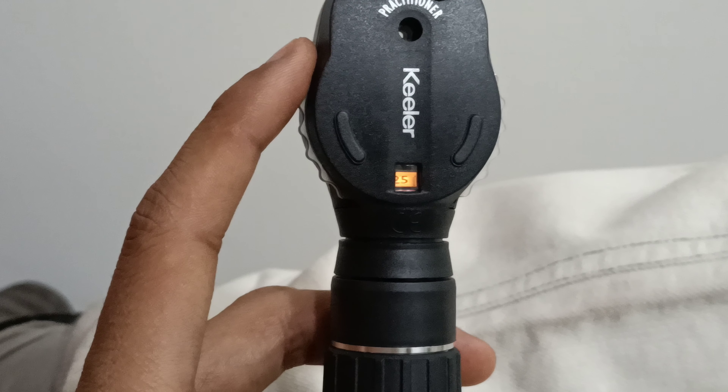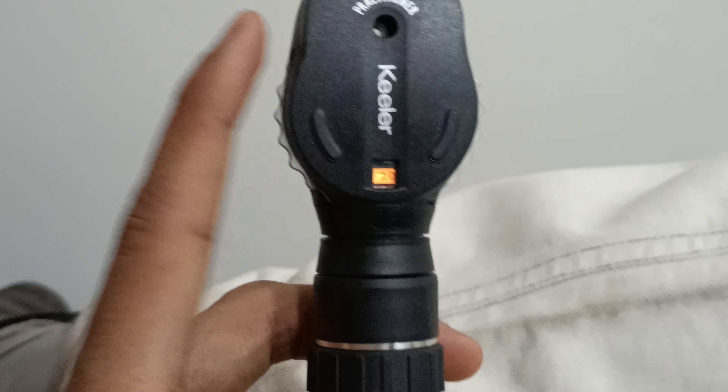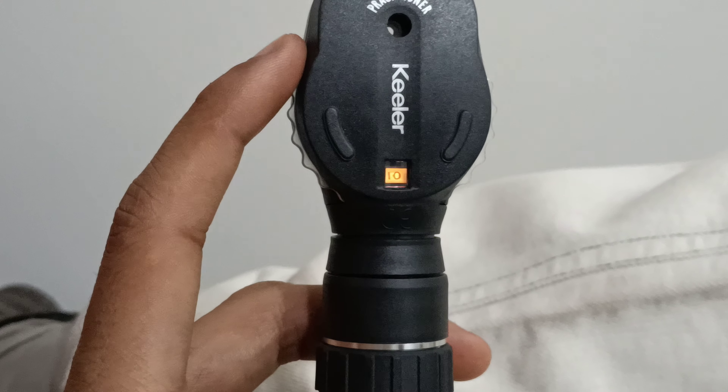So in summary, minus diopter goes up to 25, with steps at 20, 15, and 1 through 10.